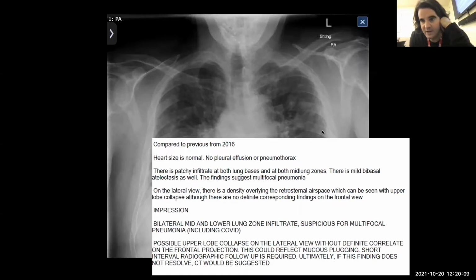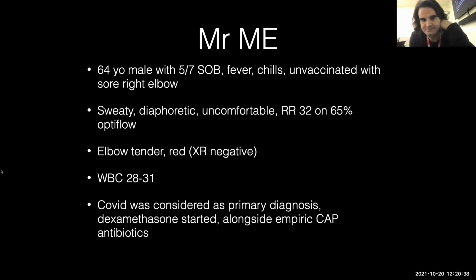Now, at this point, when I saw this gentleman, I thought, yeah, the X-ray is not overly suggestive. It could be compatible with COVID. COVID X-rays are fairly boring with scattered infiltrates. But based on the white count of nearly 30 and the fever and the kind of diaphoresis and pallor this gentleman looked like, I thought, I'm not sure if we really have a diagnosis. At this time the COVID test was pending. So we went and applied some lung ultrasound in the emerge.